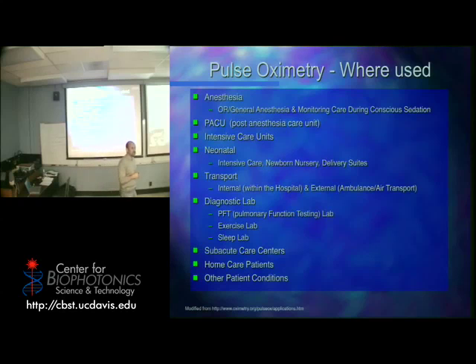Private pilots, yes. How much is the small pulse oximeter? A couple hundred dollars. You can now get some for about 150. I don't know, how many of you had a chance to see the other one that we had that shows the actual waveform? Did any of you get to see that?